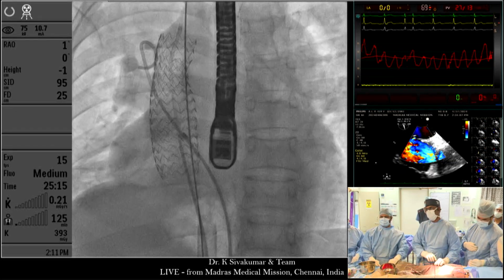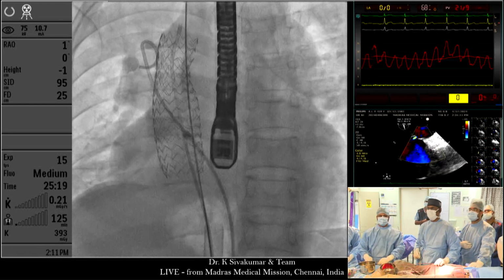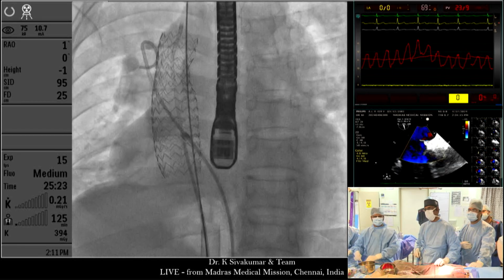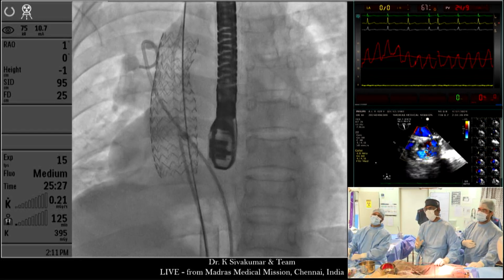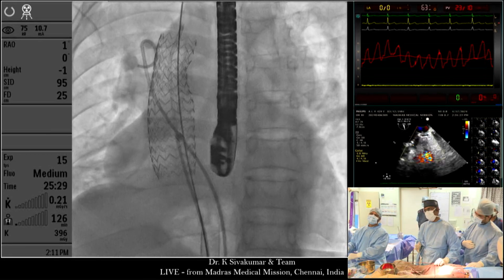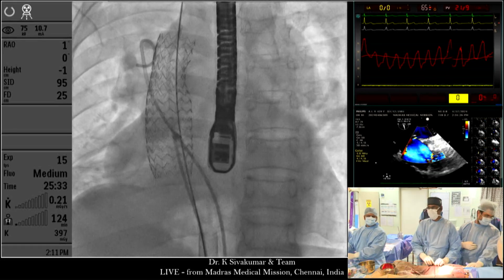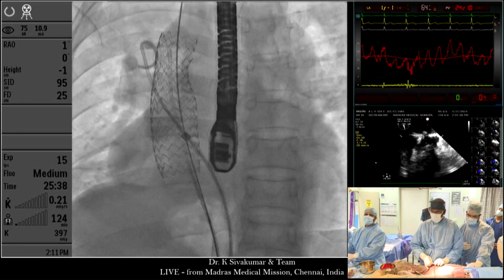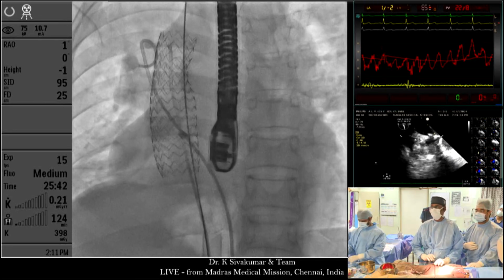Just her right diaphragm is quite elevated. Yeah, it's not moving much. However, that's a nice observation. Probably there is something like an eventration. She has never undergone any surgery so far, and she's on full positive pressure ventilation. So even if there were a diaphragm palsy, the diaphragm should move. Probably something like an eventrated diaphragm. I will look into it, however. We didn't see that. Yeah, no problem. Take it out.